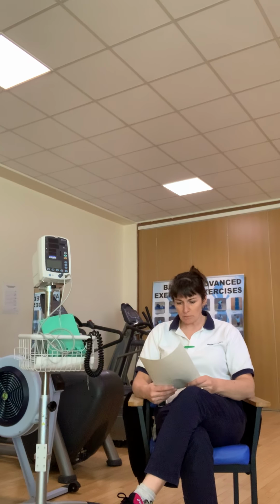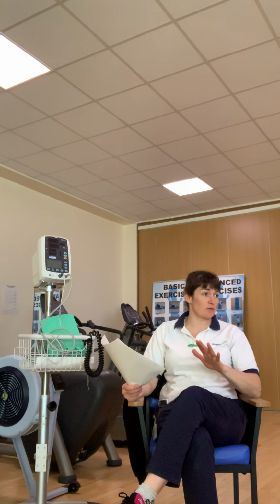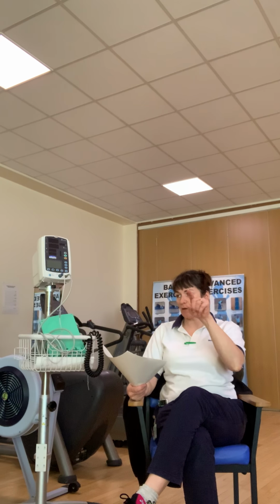Basically, you click on it, and I'll go through how you take the obs and your normal standardised readings as well. Taking the obs forms what I call a 4-point safety check before you go and see anybody on the ward. You'll be wondering where the hell am I, where things are, and we'll orientate you. In a nutshell, to check a patient's obs before you see them, they're always on the desktop, on the computers on the ward, and it's a little icon which I'll show you.